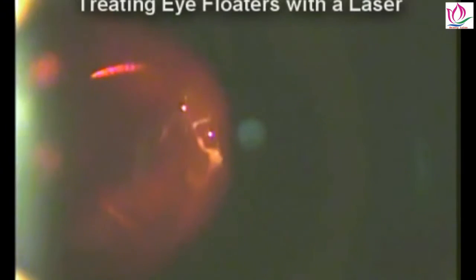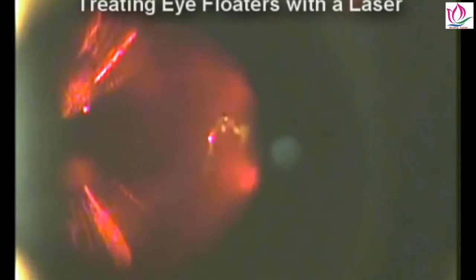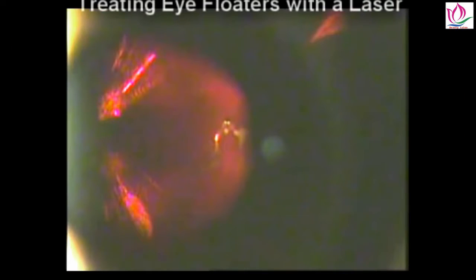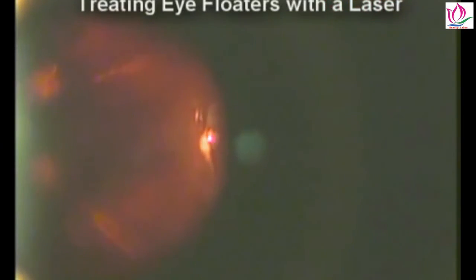You can see a little bubble or bubbles floating away with each shot of the laser. And those bubbles are micro gas bubbles, probably carbon dioxide, of the vaporization of that collagen and semi-solids. There's a freeze frame of an actual plasma burst. That's how the energy is imparted onto that floater.